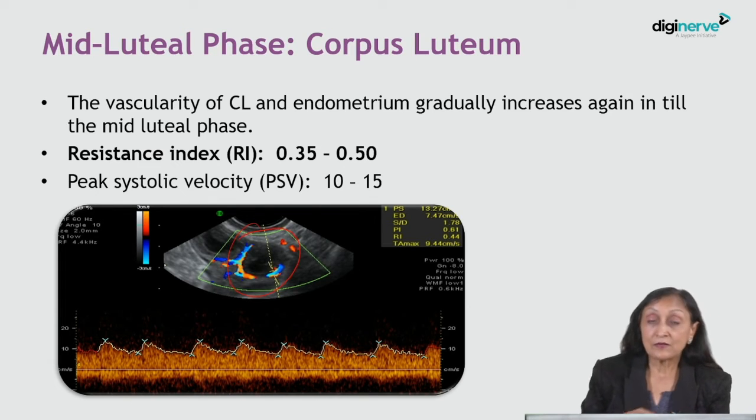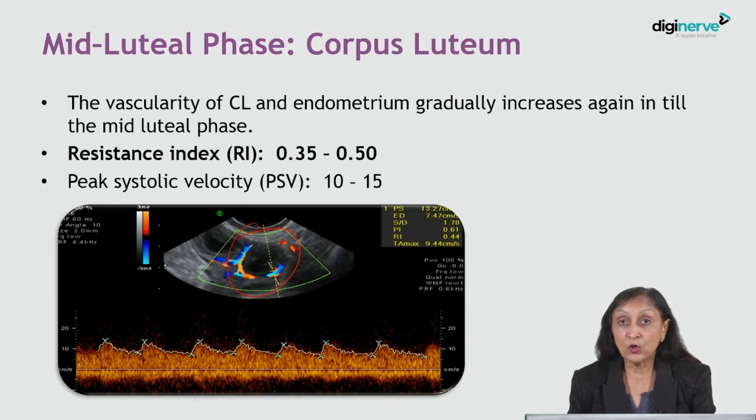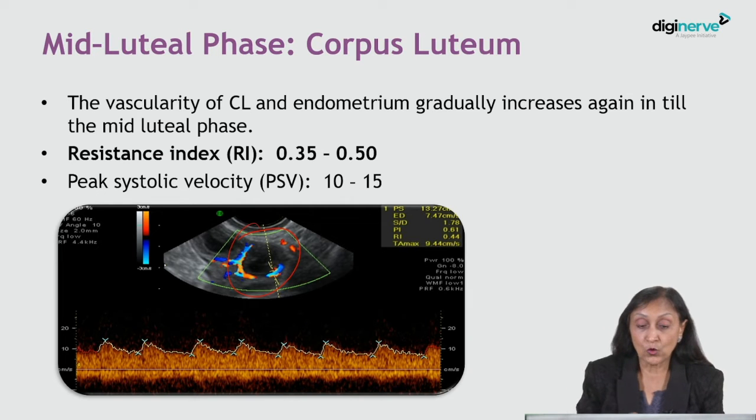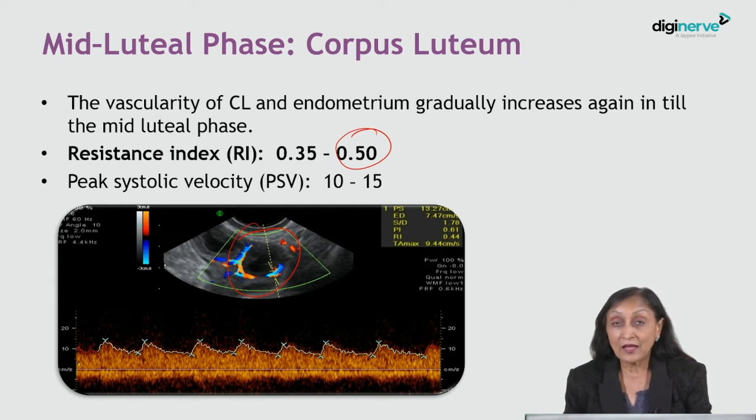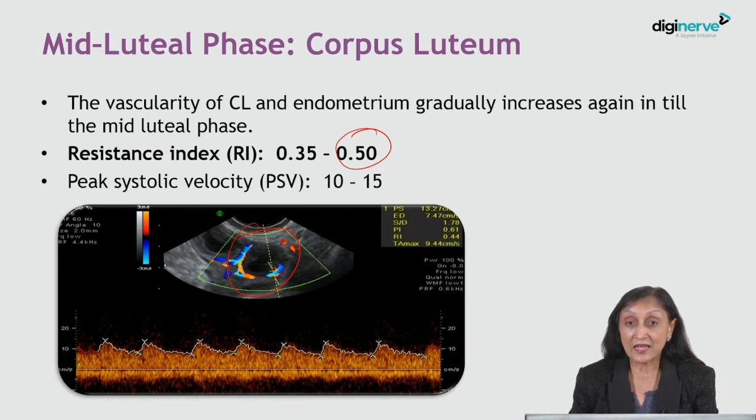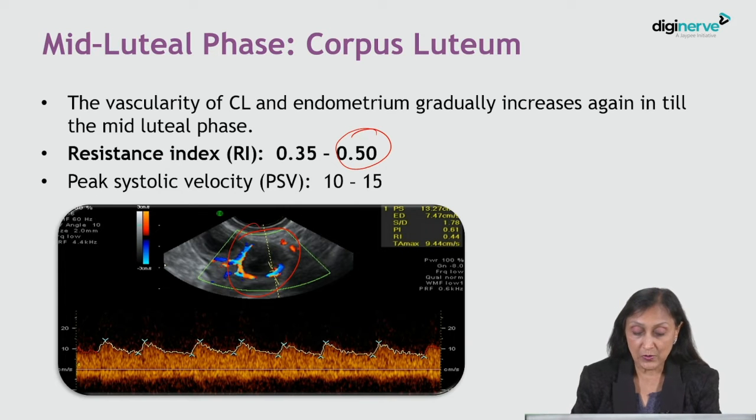In the midluteal phase, the corpus luteum shows a nice ring of color, and this flow is a low resistance flow with an RI of less than 0.5 and a PSV of between 10 and 15 centimeters per second. This indicates that progesterone production from the corpus luteum is sufficient to support the pregnancy.